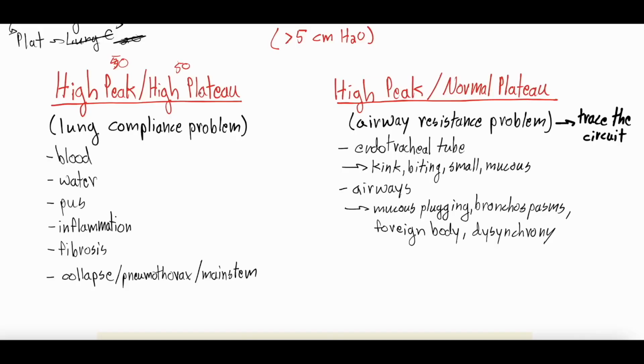Well, remember what we said. If the peak and plateau equal each other, this is really just a lung compliance problem, because the plateau pressure is lung compliance. And if the plateau equals the peak, that means airway resistance is not playing a big role, because we said peak pressure is airway resistance and lung compliance. So if they equal one another and plateau pressure is just lung compliance, again, it means airway resistance isn't playing a role.